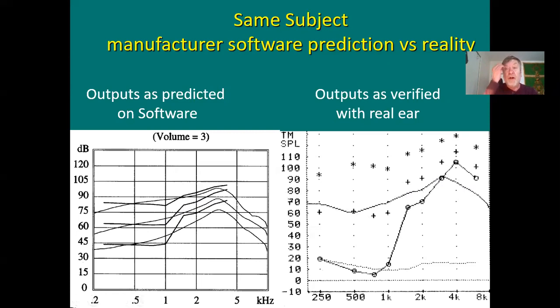Now, you wouldn't want the output to be at this plus sign, or your client would probably wind up and punch you in the head. Okay, but the point is, right, wrong, or indifferent, real ear shows you what you are getting.